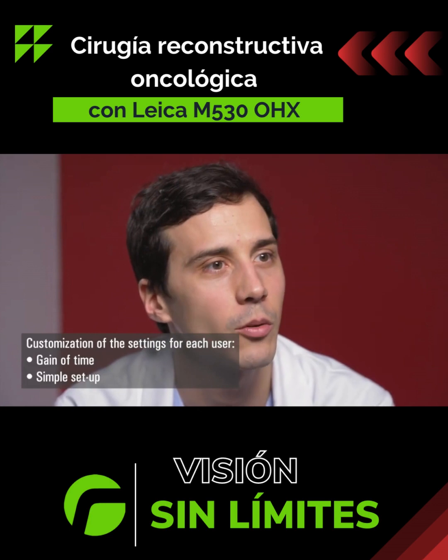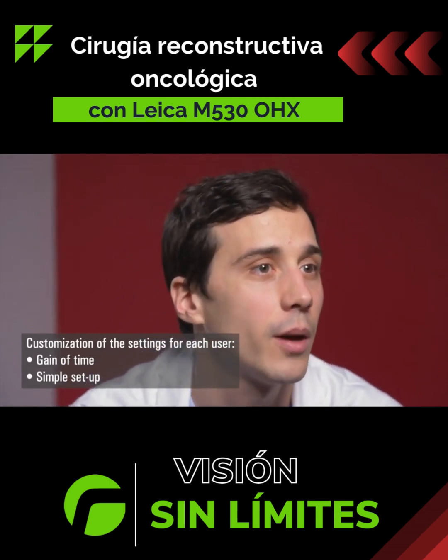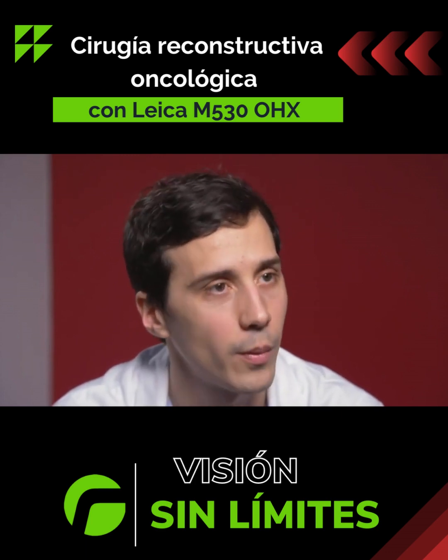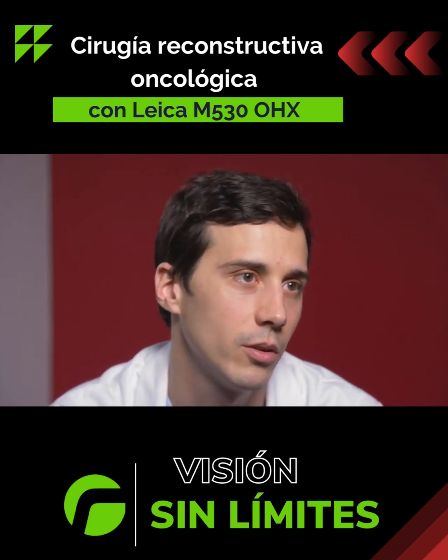The pre-configuration of the microscope makes it much easier to use, since I just have to set the plastic surgery profile, which has already been created. Unlike other microscopes, I don't need to reconfigure the parameters like the brightness, focal length, etc. It's really an additional advantage.